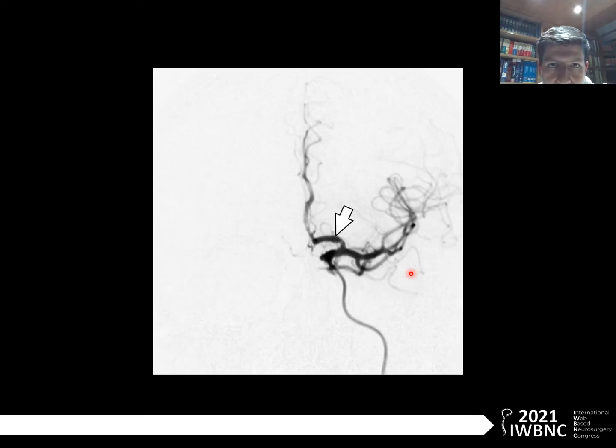In this case, a decision was made to proceed with urgent endovascular treatment of the aneurysm. The patient received loading doses of dual antiplatelet therapy for 48 hours, then was taken to the neuroangiography suite. After induction of general anesthesia, an intraoperative infusion of tirofiban was initiated, and then a Pipeline Flex embolization device with Shield technology was deployed at the A1 segment of the left anterior cerebral artery.